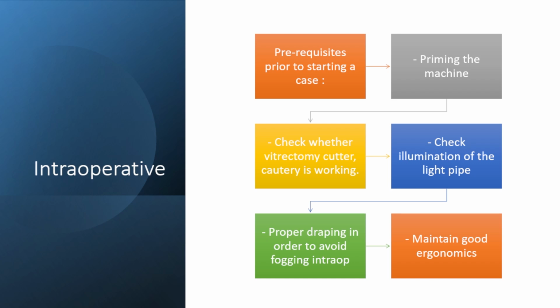The last article which you showed about the urinary catheter, it need not be a urinary catheter, any catheter should work as long as you're able to suck the gas away. And we have a lot of sterile catheters available in the OT. Maybe we should try, in one of the cases, just stick it around the nose and try to attach it to a suction and see what happens. So there's a good technique which you can definitely adopt in really difficult problems where you have an issue.